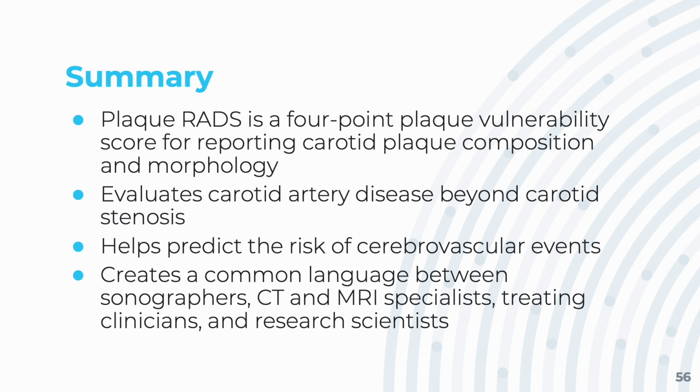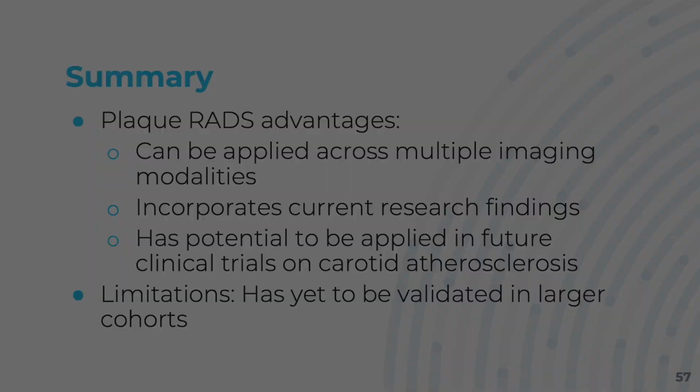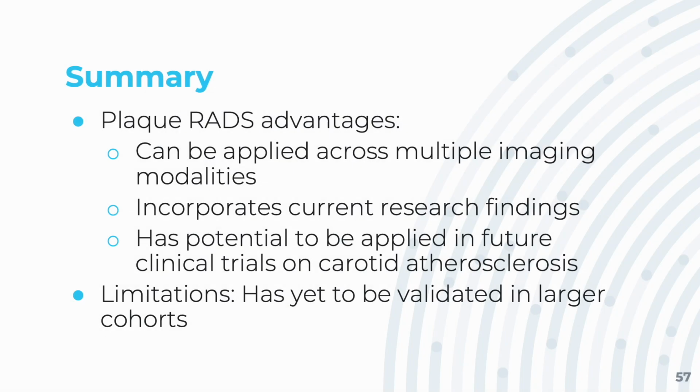And I think it's very helpful to create, because it's a common language between sonographers, CT and MRI specialists, treating clinicians, and research scientists. The advantages of the Plaque RADS system is that it can be applied across multiple imaging modalities, and it incorporates current research findings and has the potential to be applied in future clinical trials to study carotid atherosclerosis. The limitation currently is that it has yet to be validated in larger cohorts.